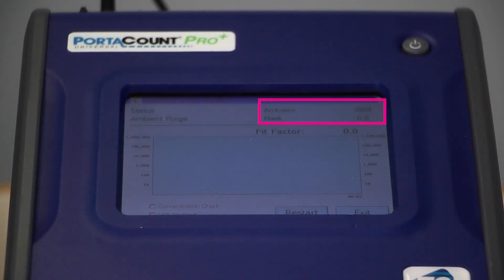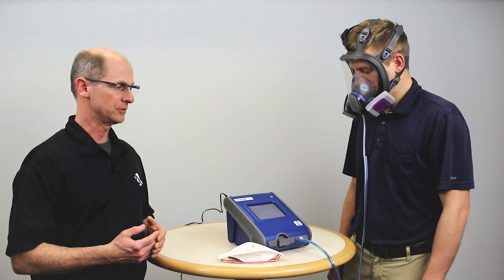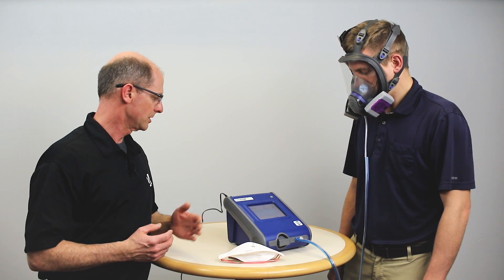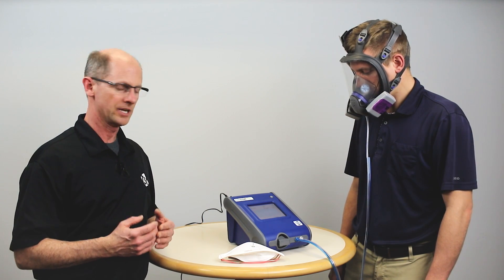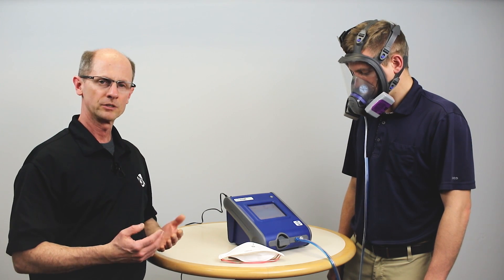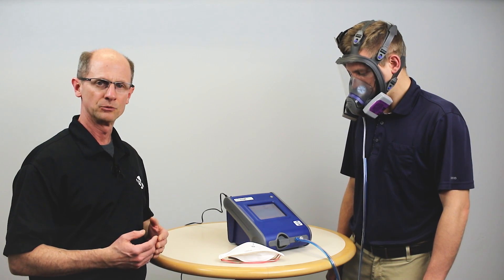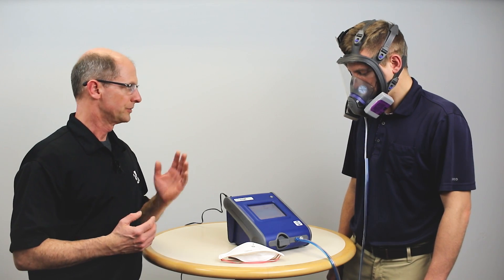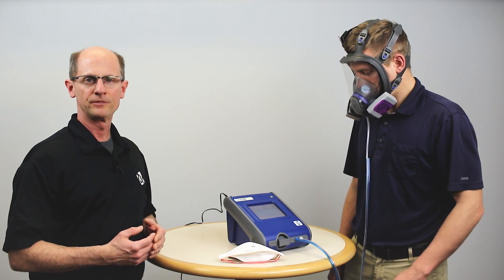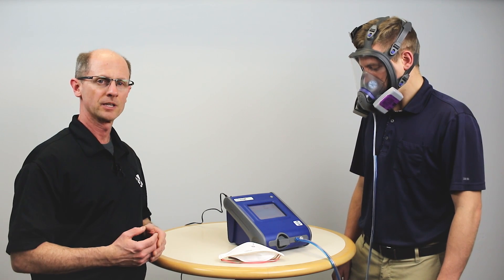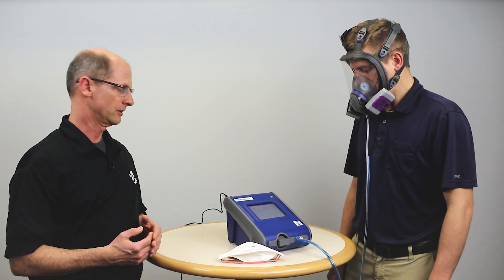It's taking an ambient sample and samples from the mask like it does with a fit test, but it's not following a protocol — it's just doing it real-time. Our ambient levels are good, and now it's going to take a mask sample and calculate what a fit factor would be. It will draw a line on the graph; with this mask we want a fit factor of 500, so the line should draw above 500.